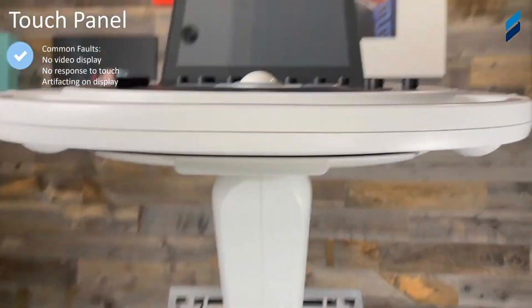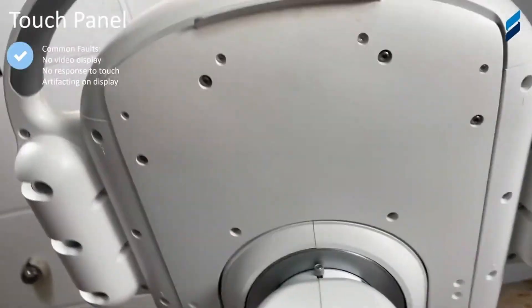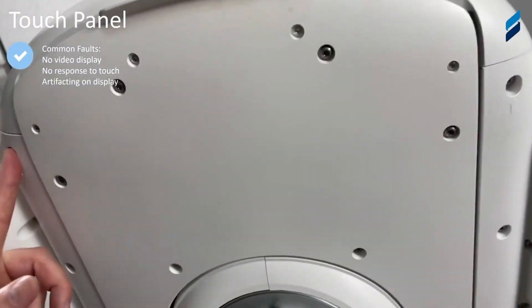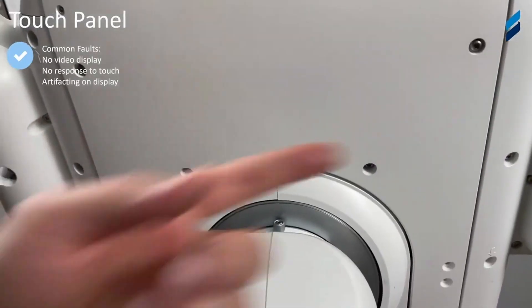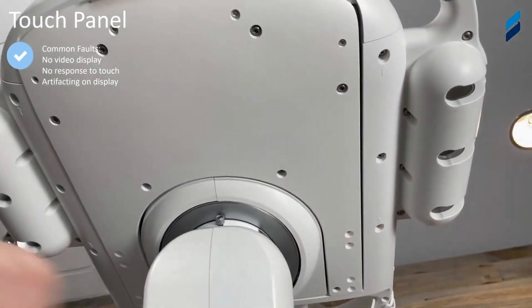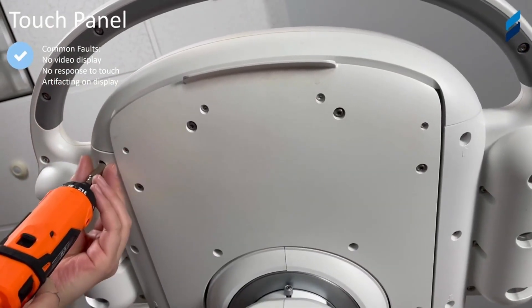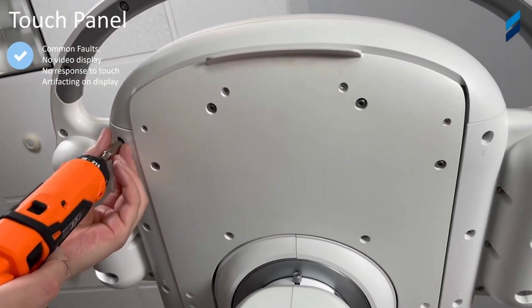We're going to look at the touch panel. With the touch panel, common faults are no video display on the touch panel itself, no response to touch, or maybe some artifacting on the touch panel. The process is very similar — we need to get to the control panel, remove that, and then remove the touch panel assembly from the control panel.